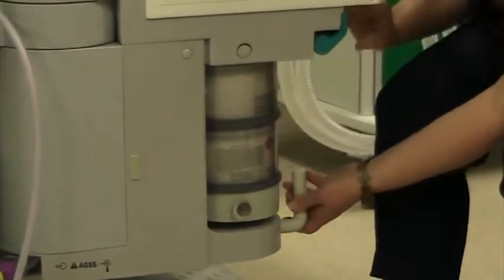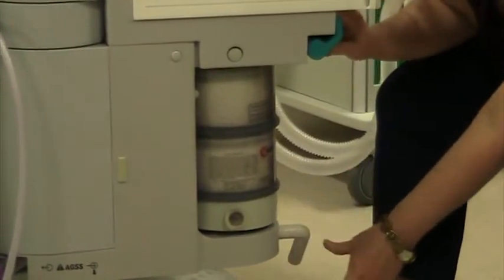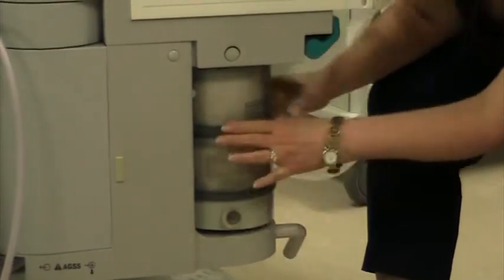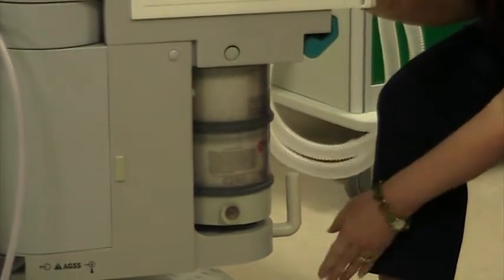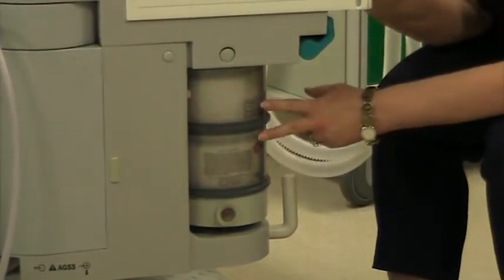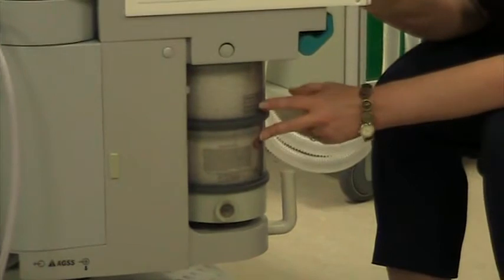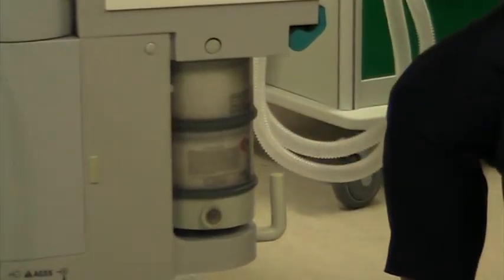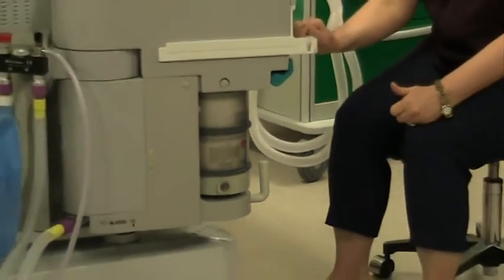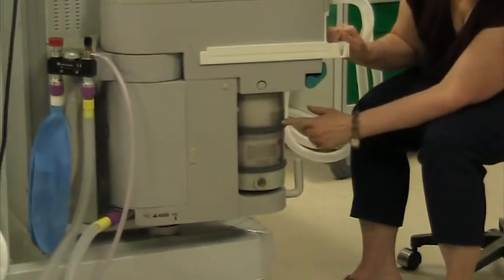So again, pull this out to let it down, put it back up, and snap it into place. Every time after you change an absorbent, you need to check and make sure that your circuit does not have a leak and is airtight.